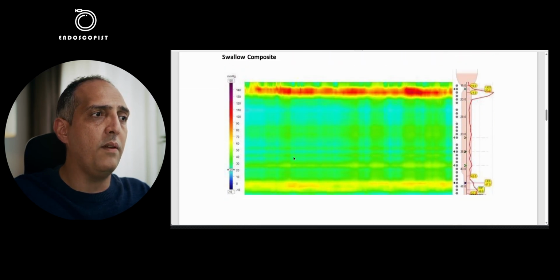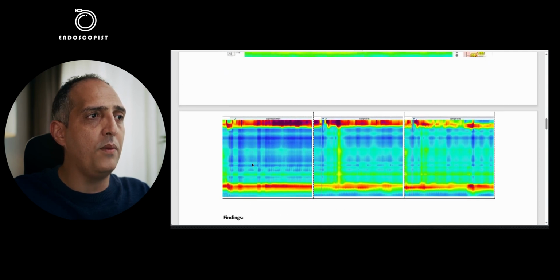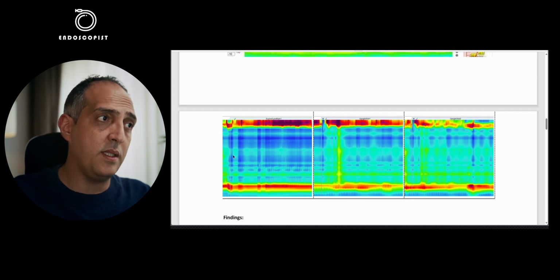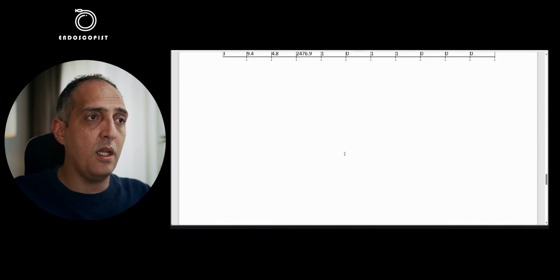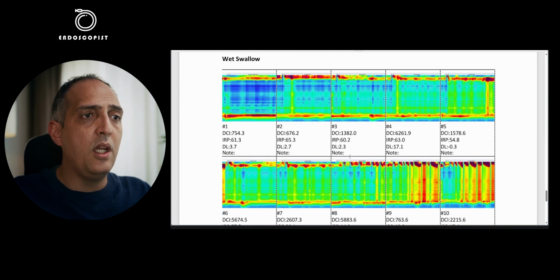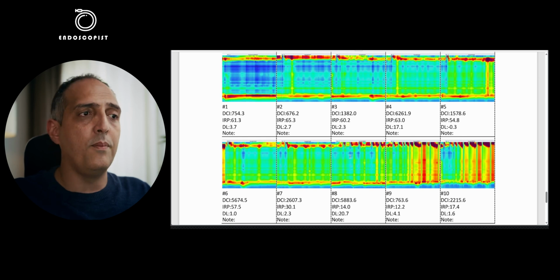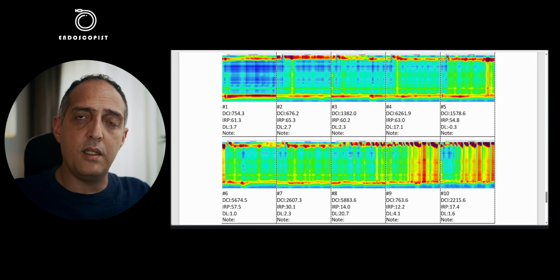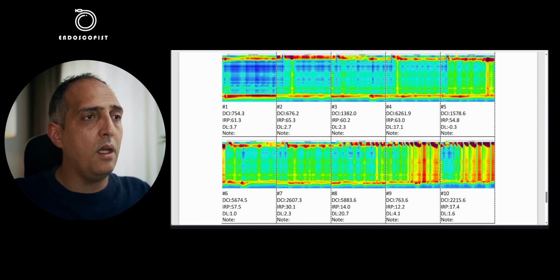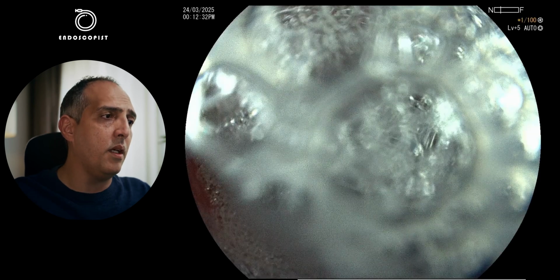As you can see here, we have high IRP and failure of peristalsis or absence of peristalsis in the whole esophagus with panesophageal pressurization. So this is a clear diagnosis of type 2 achalasia. And we decided, after discussing it with the patient's parents, to go for peroral endoscopic myotomy as the best treatment option. So let's see now the endoscopy.